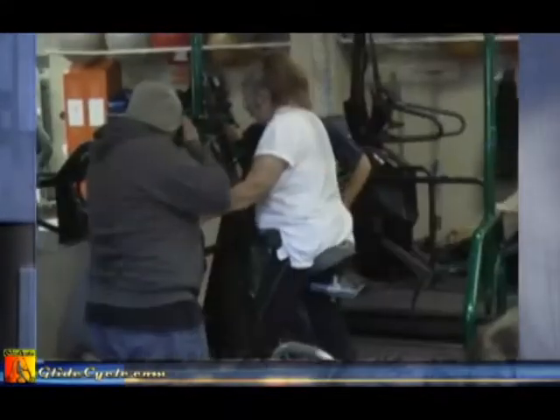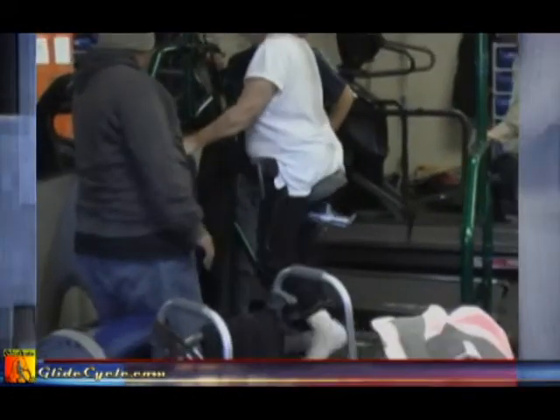Oh, that's really fantastic. And you feel the clients are being treated really well compared to pool therapy, or how would you compare it? Well, this allows them to run through a motion, and obviously they don't have the resistance of the water. Whereas in pool therapy, they're also unweighted to a point, but they have the resistance of the water, so they can never really run or get a real brisk or intense cardio workout that their body may be accustomed to.